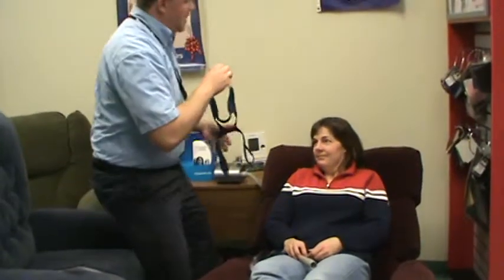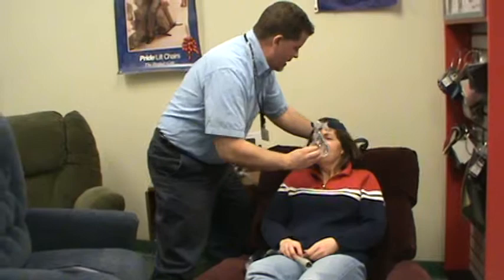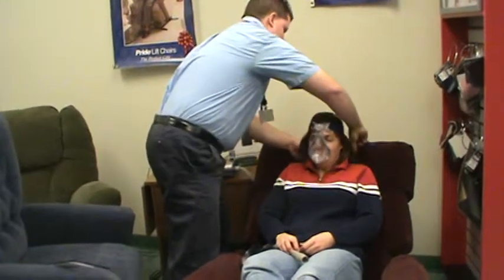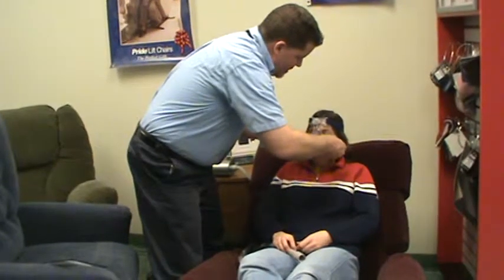Now we're going to put the mask on your face. We want the top of the triangle to go in between each eye, and we want the bottom of the seal to fit in the crease of your chin. Go ahead and place it on your face and get it over your head, and we're going to clasp you in along with your hair.